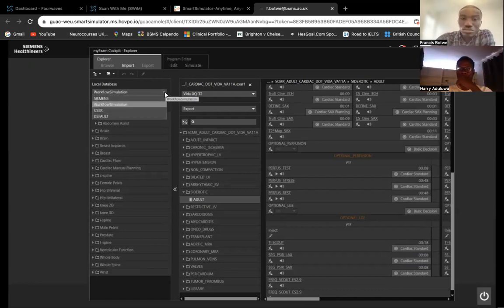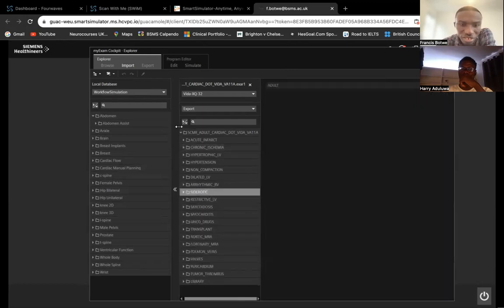Yeah, so because these sequences were still sitting in there, it didn't allow me. So I have to select a different folder. This is the workflow folder. Then it can permit me to move the sequence.